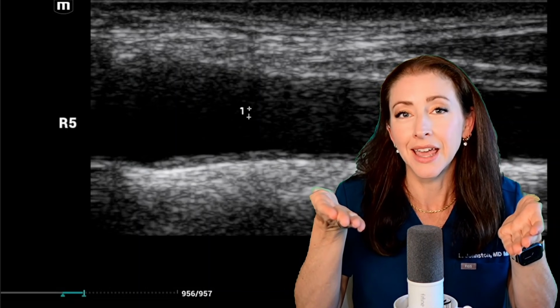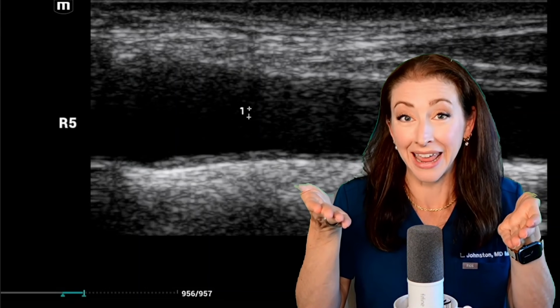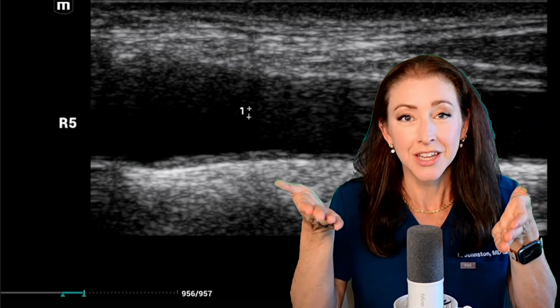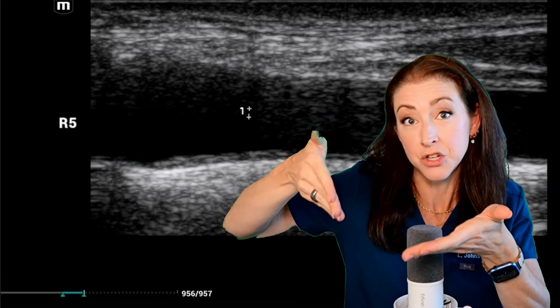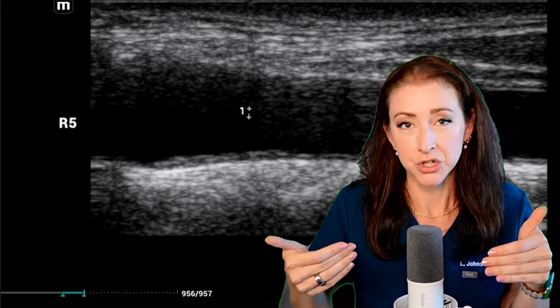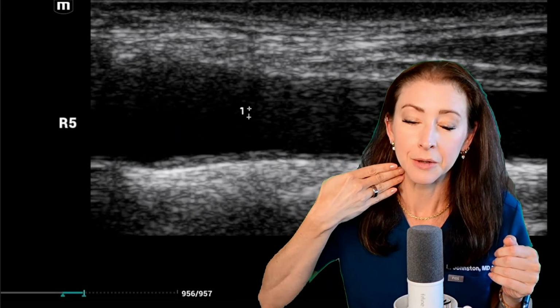So in order to get the most precise estimate, we're actually going to take three different angles of pictures so that we have multiple aspects of the back wall to image from, and those measurements will be averaged. So the R5 image that we take, that's the very first picture, is taken from about a 45-degree angle off the front of the neck.